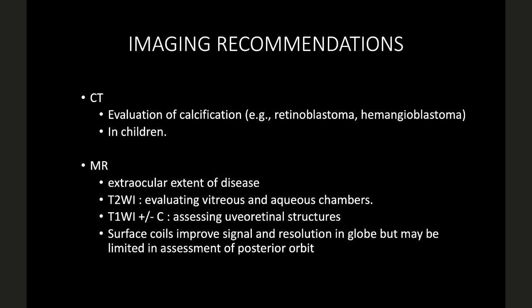So the imaging recommendations, we already went through it, but there's another way of approaching. I took you down the pathway of anatomy, right? And then I said we're not talking about pathology at this time. So here is a pathology. If I'm looking for something which has calcification, right? You guys know some of these tumors are calcified. It's retinoblastoma, hemangioblastoma. I can see it on my MR also, but the CT is going to pick up these things better, right?